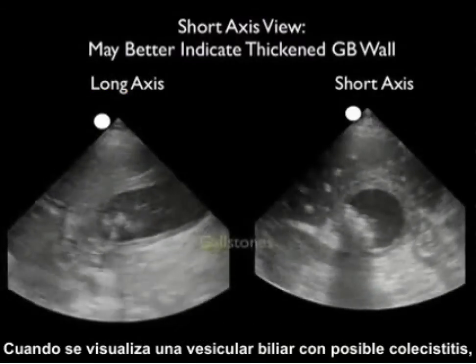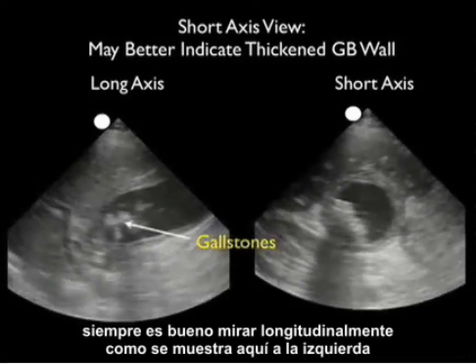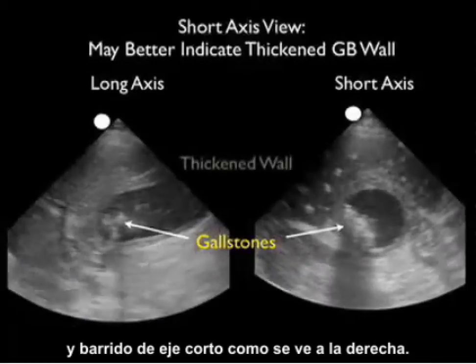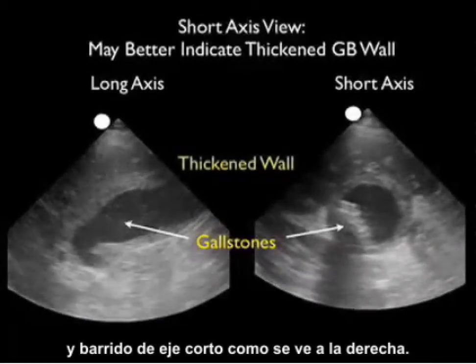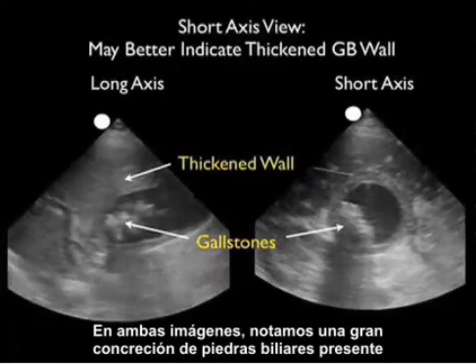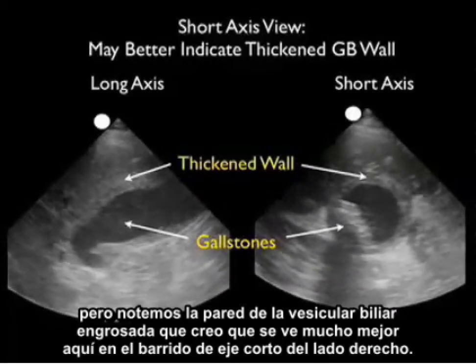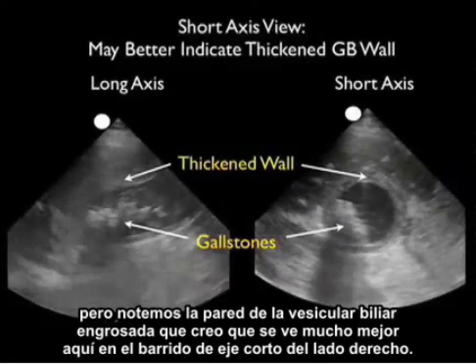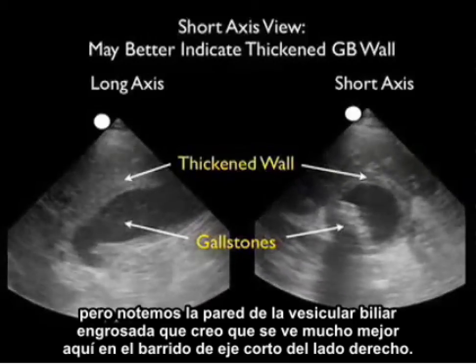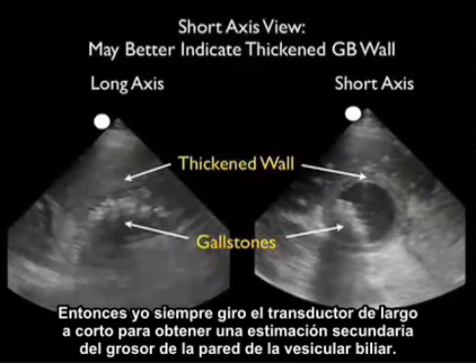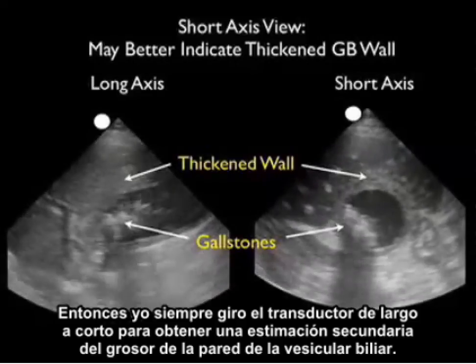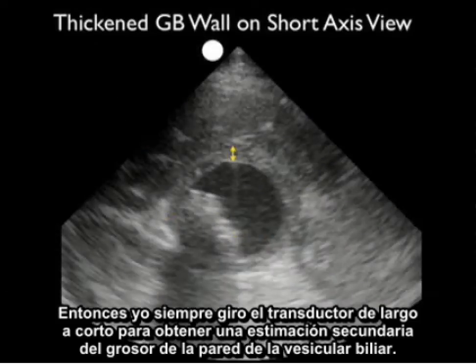When imaging a gallbladder with possible cholecystitis, it's always good to look in a long axis scan, as shown here to the left, and a short axis scan as seen to the right. In both of these images we note a large concretion of gallstones present, but notice the thickened gallbladder wall that is much better seen here on the short axis scan to the right side. So I always swivel the probe from long to short to get a secondary assessment of how thick that gallbladder wall is.